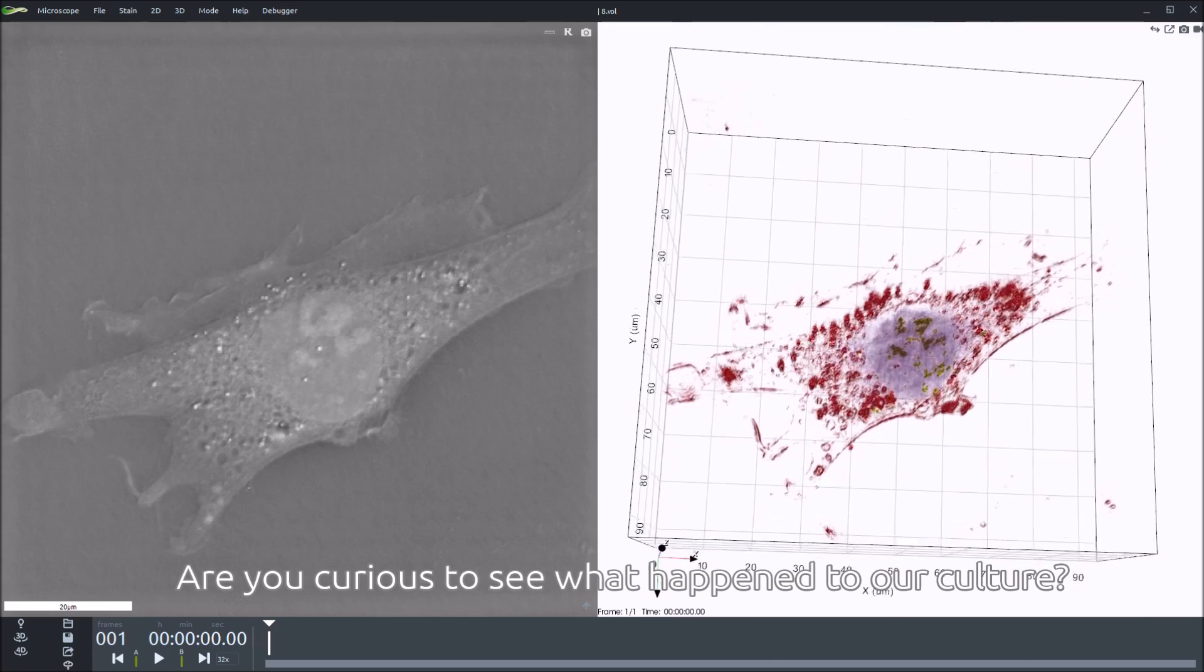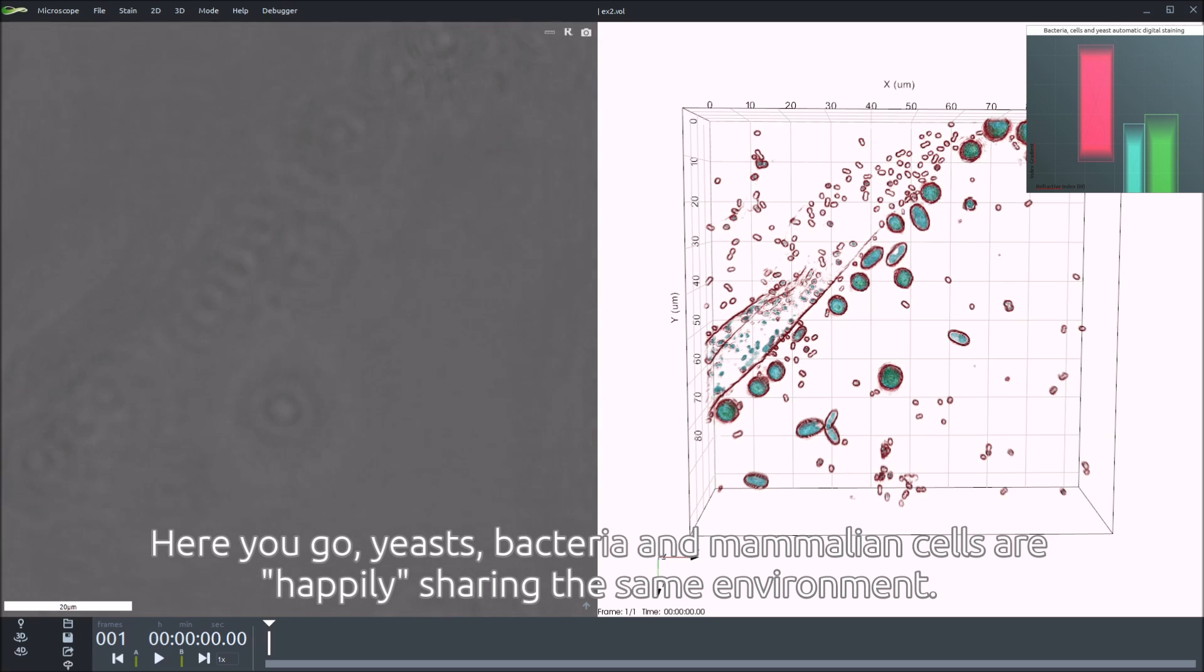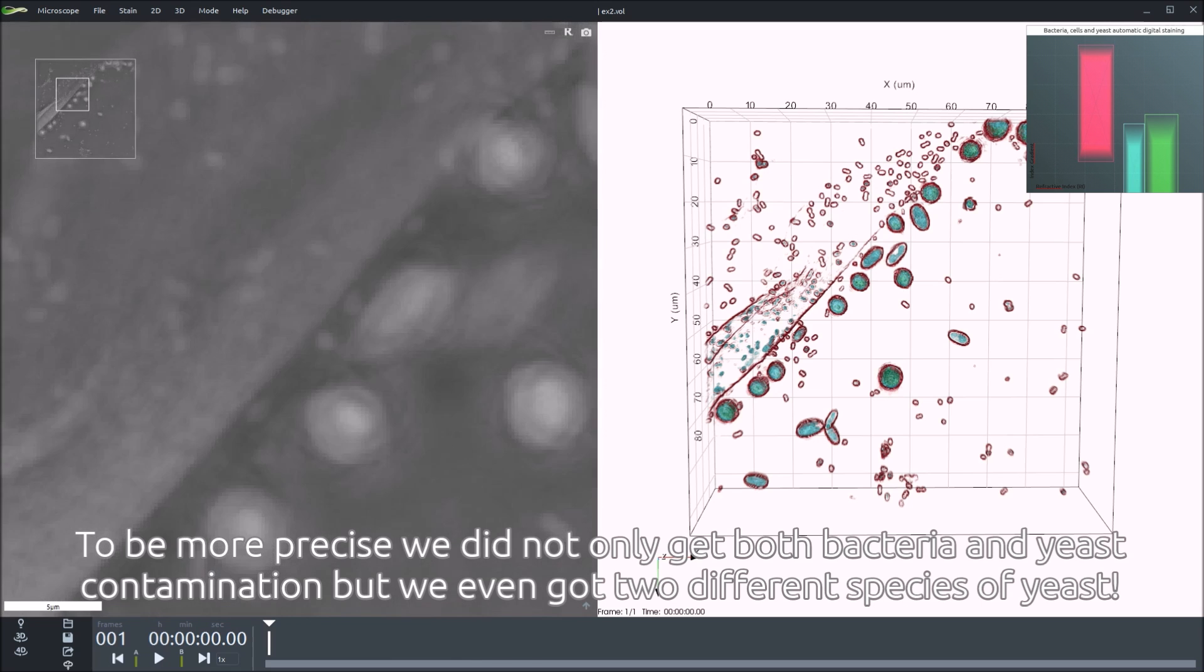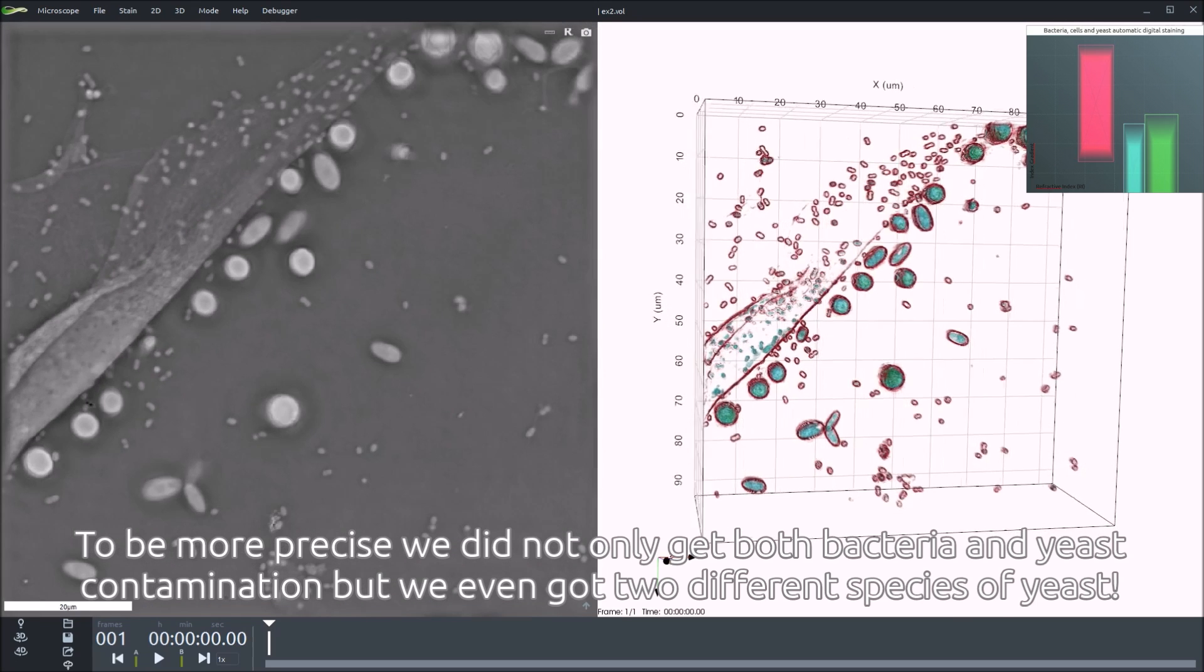Are you curious to see what's happened to our culture? Here you go, yeast, bacteria, and mammalian cells are happily sharing the same environment. To be more precise, we did not only get both bacteria and yeast contamination, but we even got two different species of yeast.